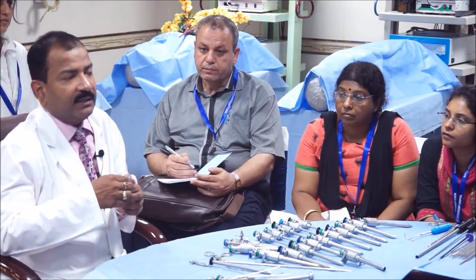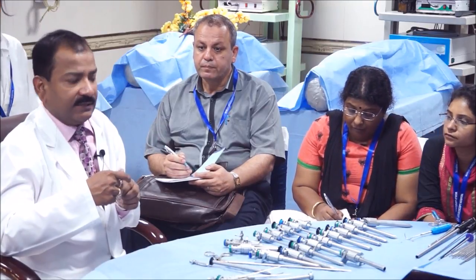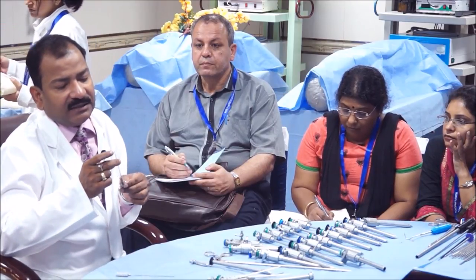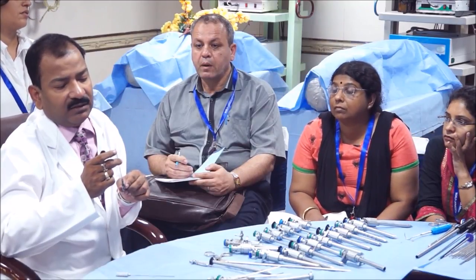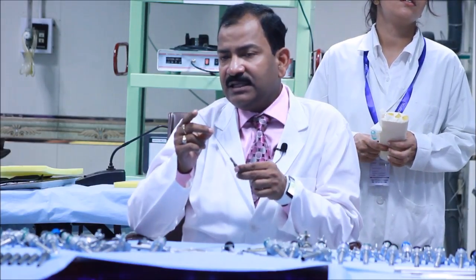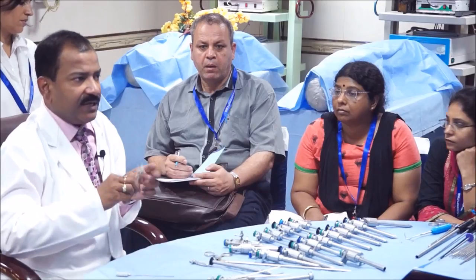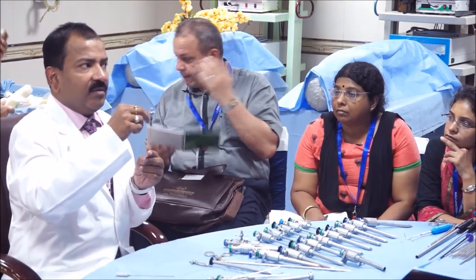So, Veress needle has 2 parts. One is needle, other is a stylet. This is the needle and this is a stylet. A stylet has one eye at the tip, but this eye is not on the tip, it is on the side. The eye is on the side and tip is blunt. Tip is blunt. It has one spring here and one valve.